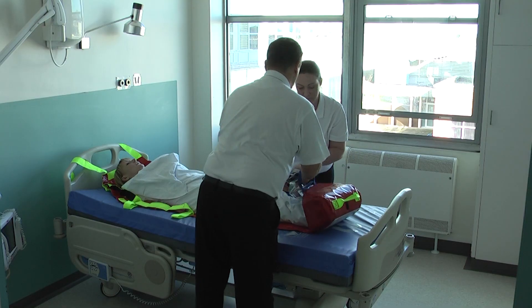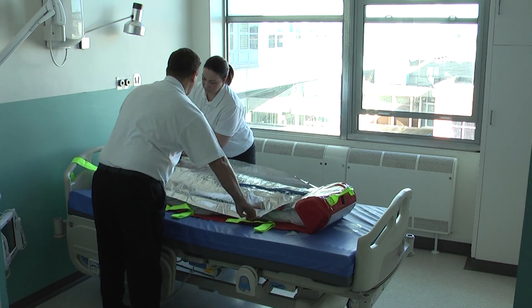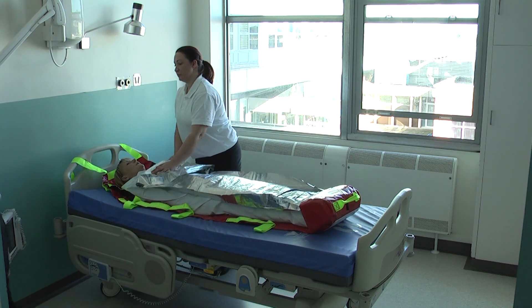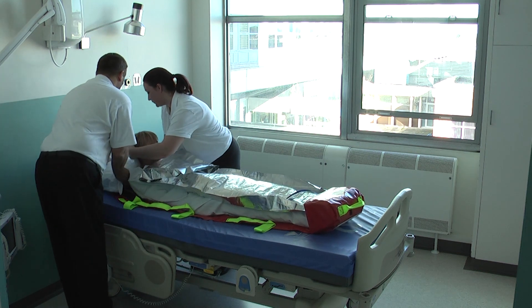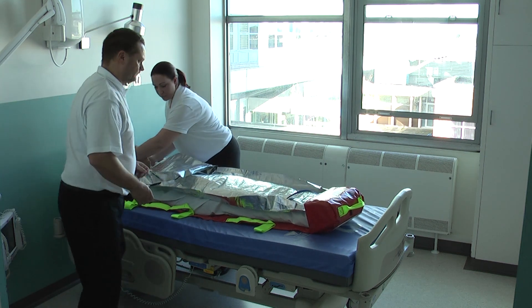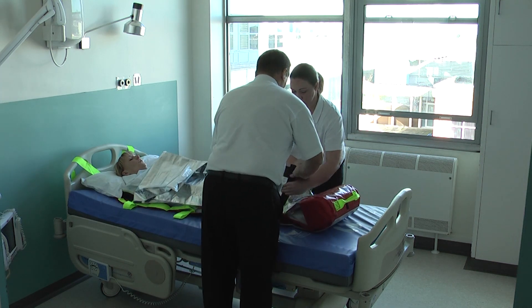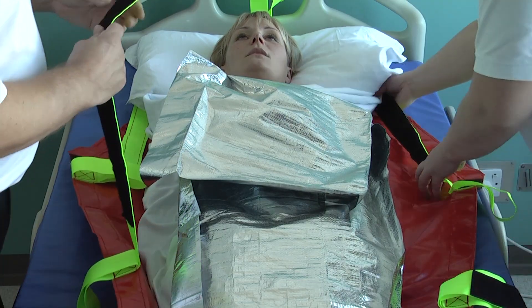Place the foil blanket over the user — this can be found in the foot pocket. If available, position a pillow under the user's head. Working in pairs, fasten the straps across the user's chest and knees ensuring they are tight but comfortable.